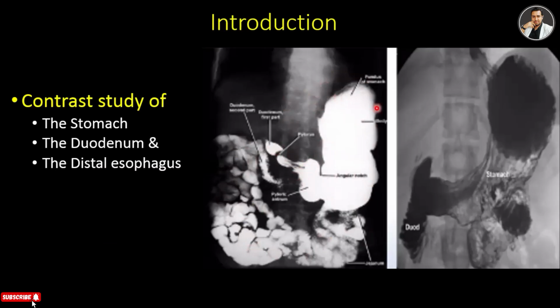So when it talks about only the stomach, it's called the barium meal, and when the small intestine is added with the stomach, then it's called the barium meal with follow through. And sometimes barium follow through can be advised separately, and sometimes barium meal with follow through is advised. And the second image is actually a fluoroscopy image, so it looks like an inverted image.